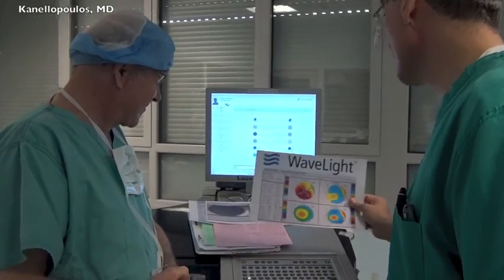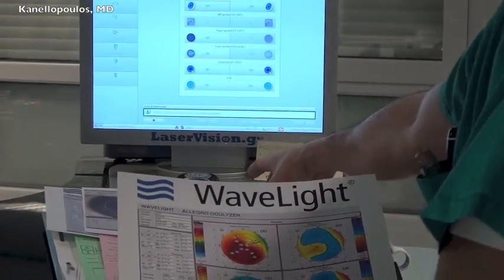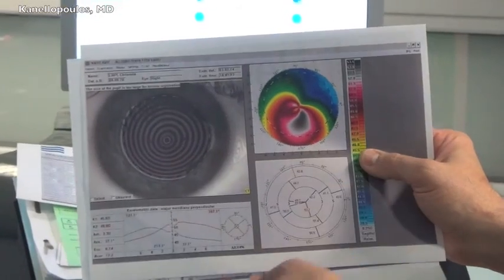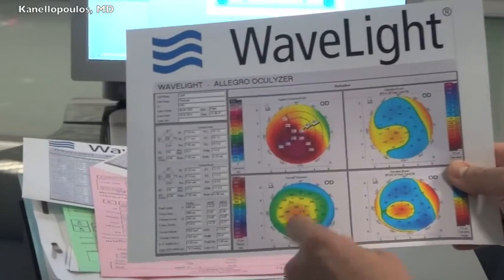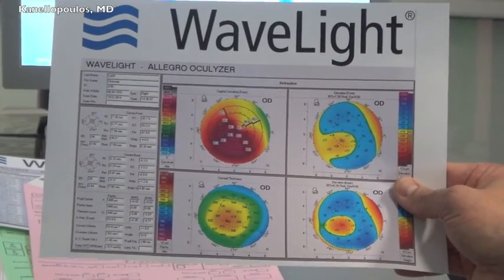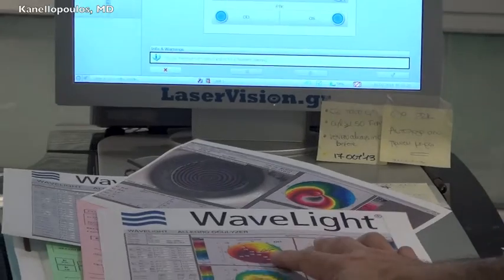So this is a young lady. She's in her 30s. We're just discussing with George whether this is keratoconus or maybe pellucid or somewhere in between, because there's a claw-like appearance on her Placido disc topographies. And the Pentacam shows that it's probably keratoconus because we can see that the periphery of this cornea is thicker than the paracentral area that's ectatic. Her minimal thickness is 444 per Pentacam, and I'm going to try first.